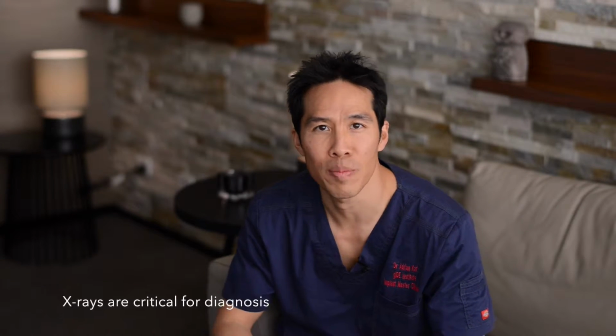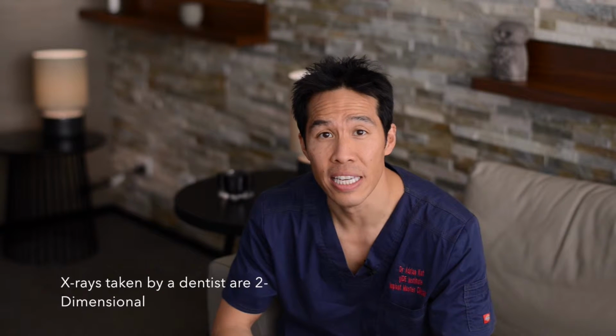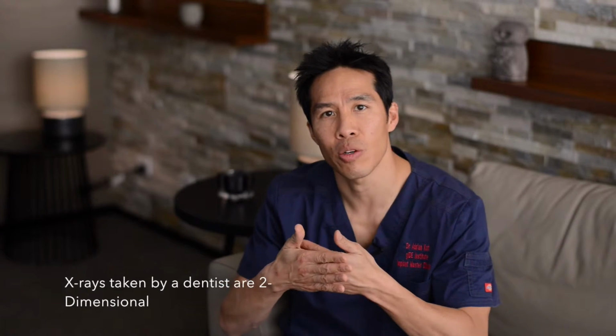So one of the things is we take a lot of x-rays, as you probably know, of x-rays in the mouth. The idea here is to really get an idea of all the things that we need to diagnose before deciding what treatment to actually do. The main issue with all of these x-rays is actually that they're two dimensions. So we can only really see certain things, but it's a flat image. We don't get to see everything in 3 dimensions.